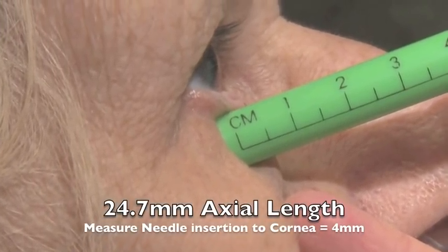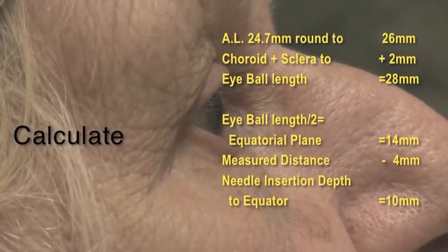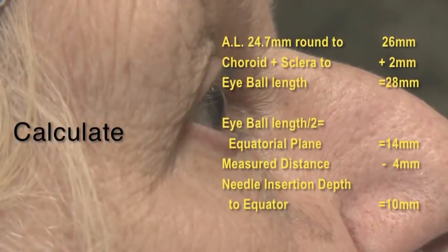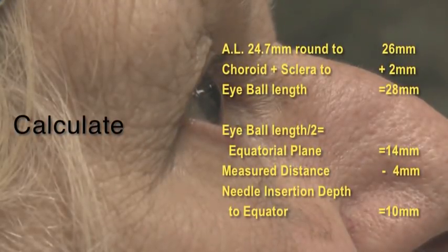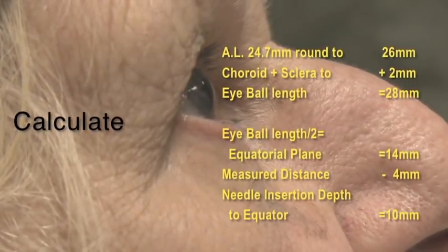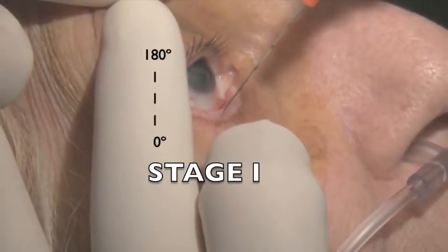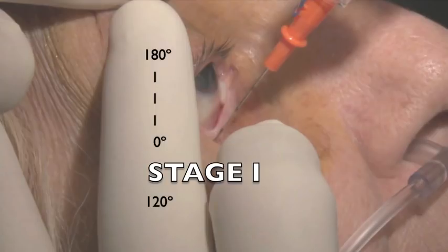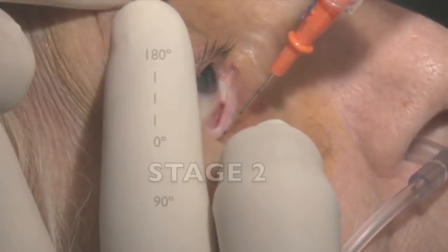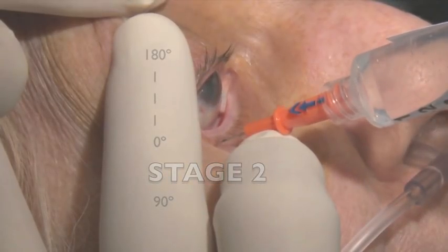Here now is the transcutaneous approach. Measure the distance from the needle insertion site to the cornea to determine the dynamic orbital globe relationship, here approximately 4 millimeters. Round up the 24.7 millimeter axial length to 26 millimeters and add the choroid and scleral length of 2 millimeters; the eyeball length is 28 millimeters. Half the eyeball length is the equatorial plane at 14 millimeters. Subtract the initial measured distance of 4 millimeters, and you get the needle insertion depth to the equator: 10 millimeters. Stage 1: insert the needle tip with the bevel towards the globe, 2 millimeters lateral to the limbus and 2 millimeters inferior to the globe at 120 degrees towards the orbital floor through the skin. Stage 2: redirect 90 degrees and slowly advance the needle tip posterior, passing the calculated equatorial plane of the globe in the extraconal space.